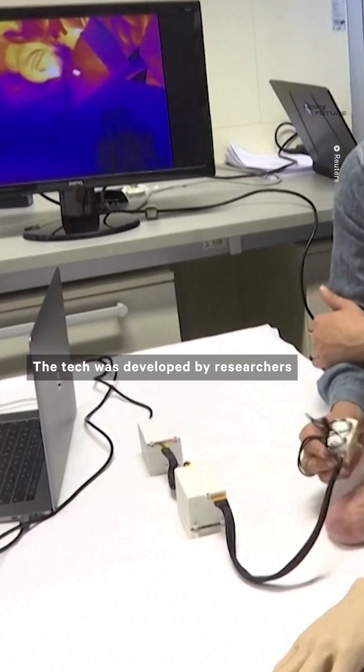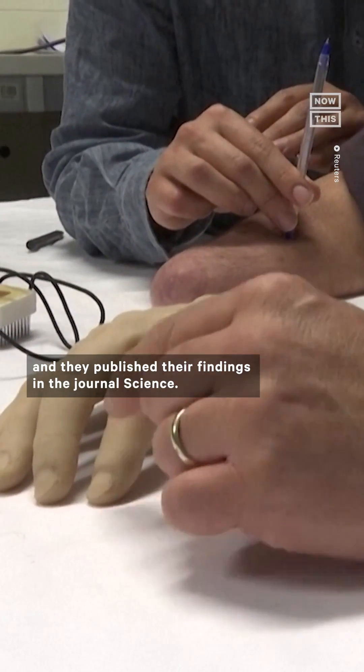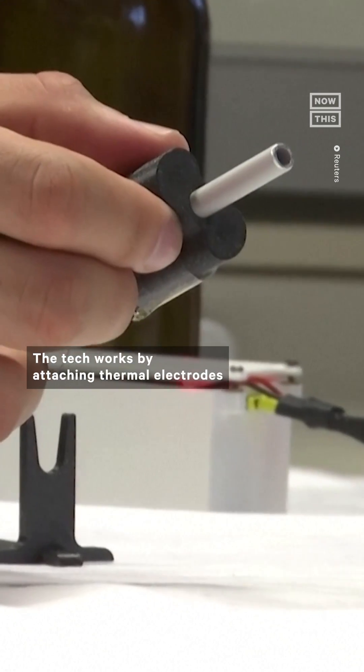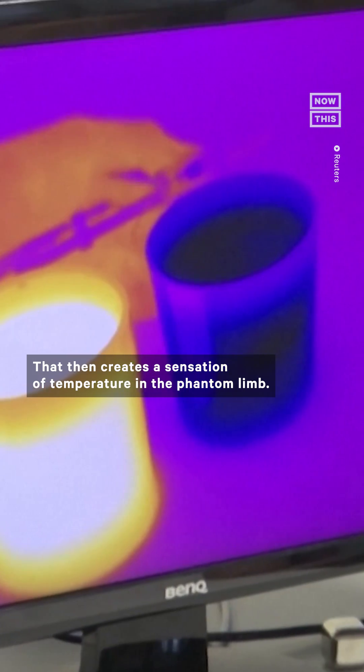The tech was developed by researchers at the Swiss Federal Institute of Technology, Lausanne, and they published their findings in the journal Science. The tech works by attaching thermal electrodes which stimulate parts of the residual limb to the body, and that then creates a sensation of temperature in the phantom limb.